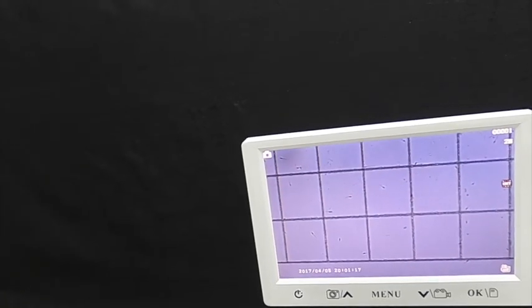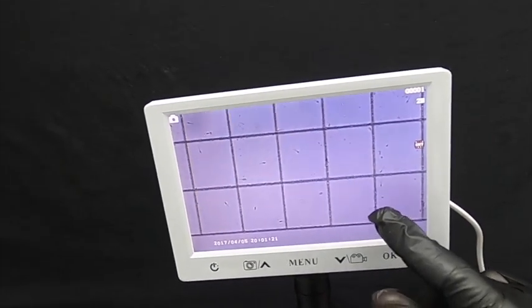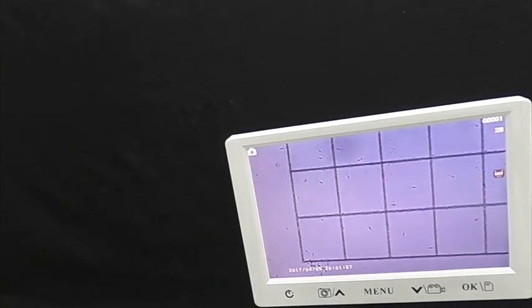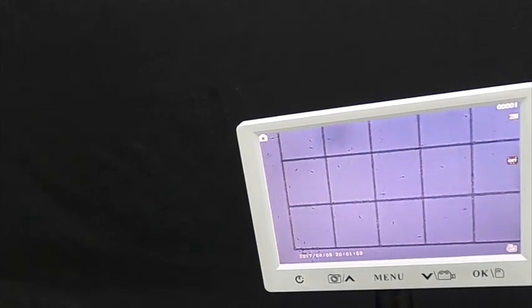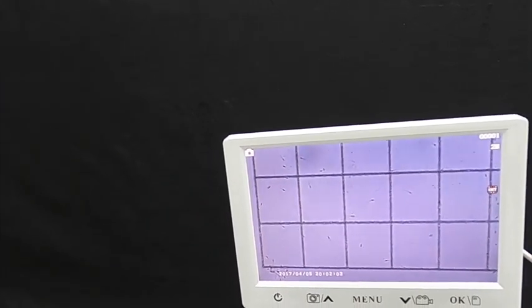Okay, so now we're going to count all the ones we can see within the grids. So starting from right to left, I have one, two, be looking for the long tails, the flagella. So here we have good ones in view. We're going to count this up again and average the two counts.